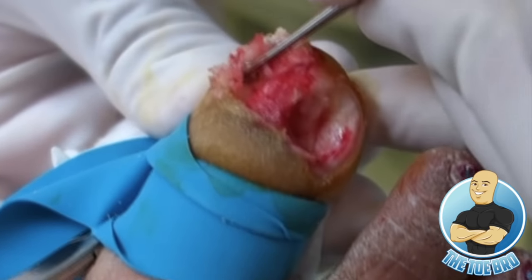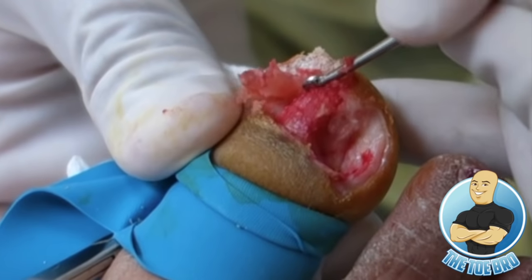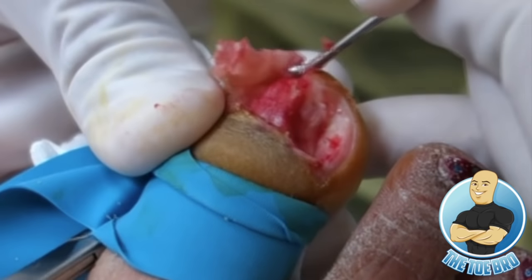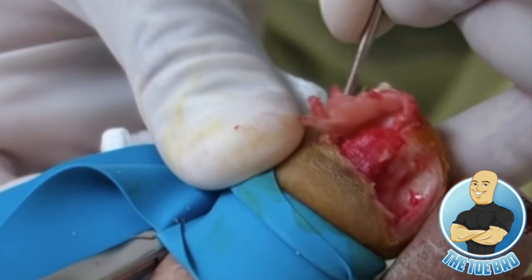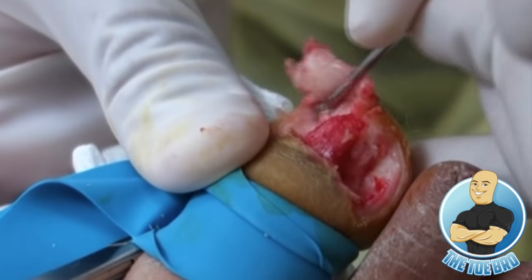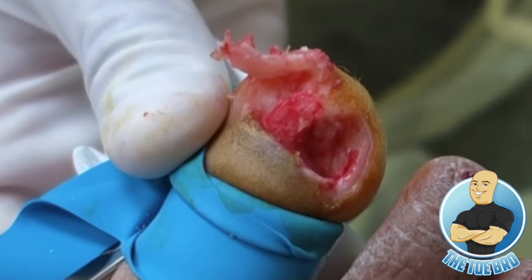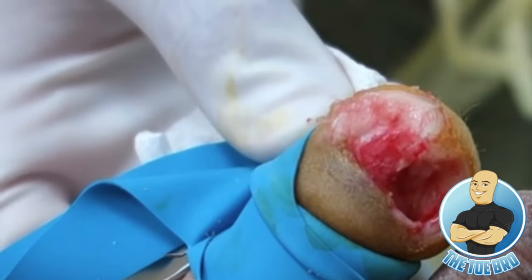The really interesting thing about warts is that they're encapsulated in this firm, rubbery substance. So they do not go deeper than the top layer of skin. So all we need to do to remove them is score around the warty tissue and then use some sort of curette or scooping tool to pull the warty tissue off of the bottom layer of skin. That way it really comes out in one piece. We can see very clearly if there's any warty tissue left behind. And the goal after we remove that encapsulated tissue is to scrape down the remaining tissue around it just to make sure there's nothing left behind. After that's done, we normally apply some sort of electrical cautery or chemical cautery to kill any remaining warty tissue left behind.